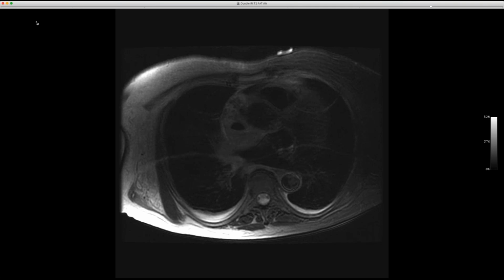So Jeff, the interatrial septum is a place I look in every leukemia and lymphoma patient. I've seen at least a dozen cases now, including this and other ones that we've shown. I don't know why, but it's a place that they'll both occur. That's good to know.